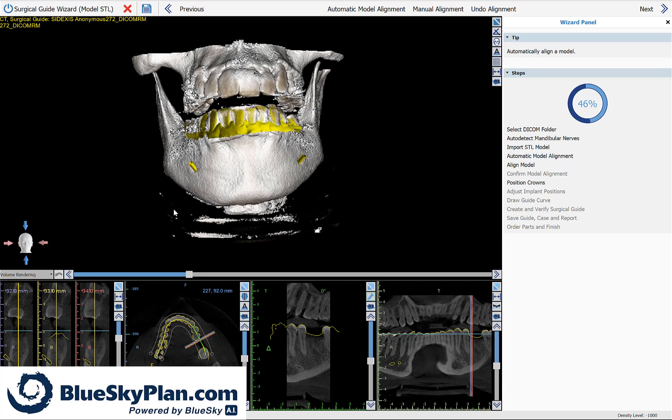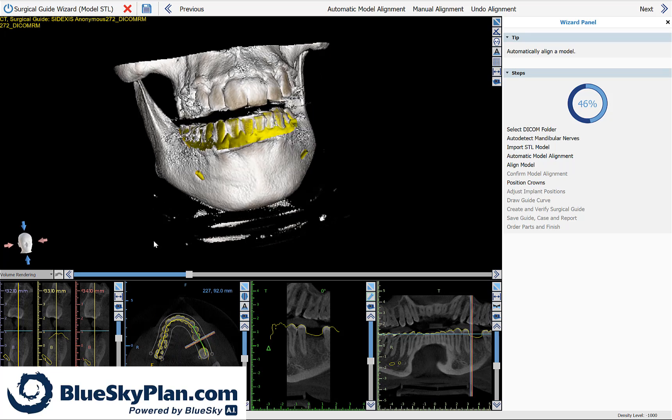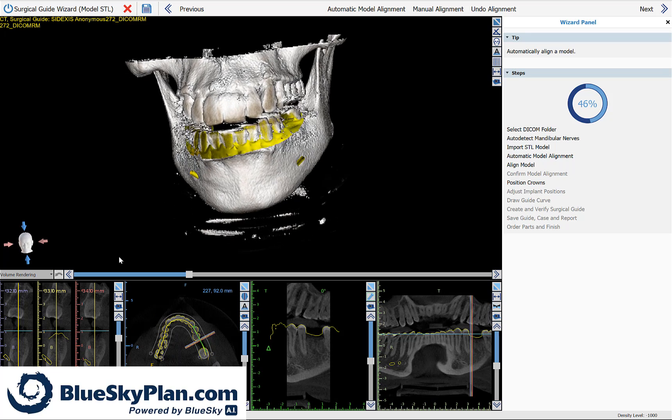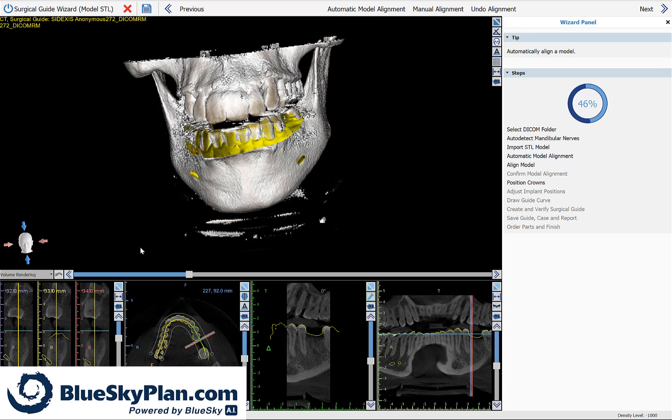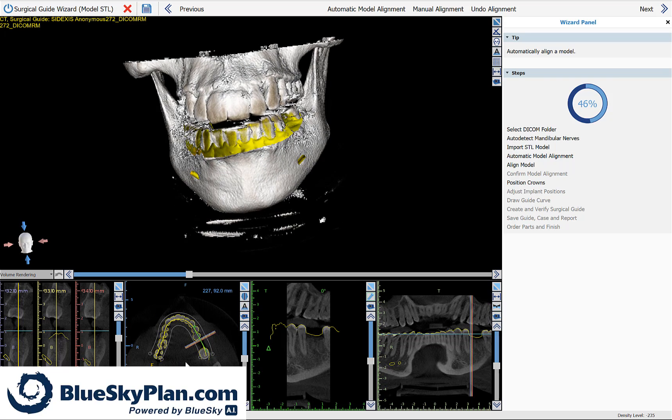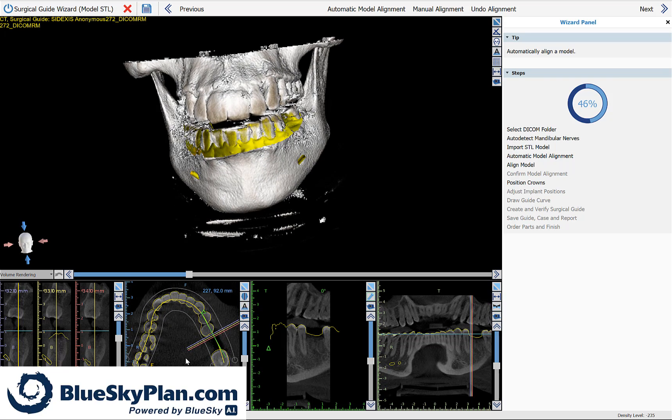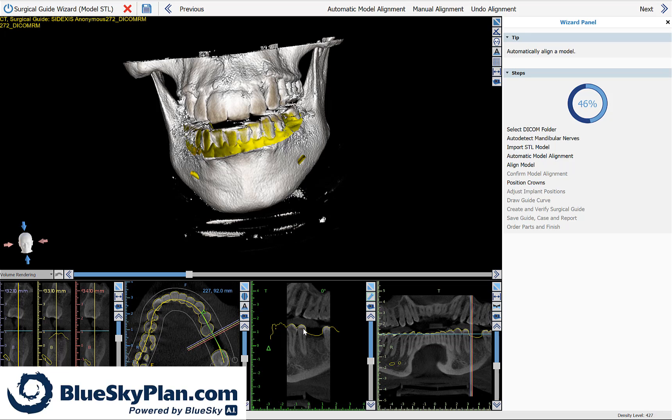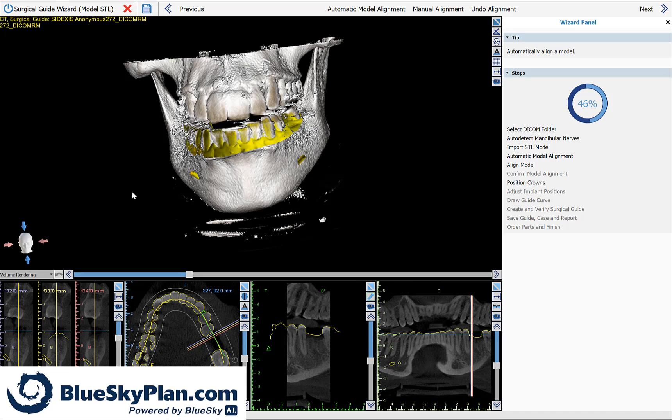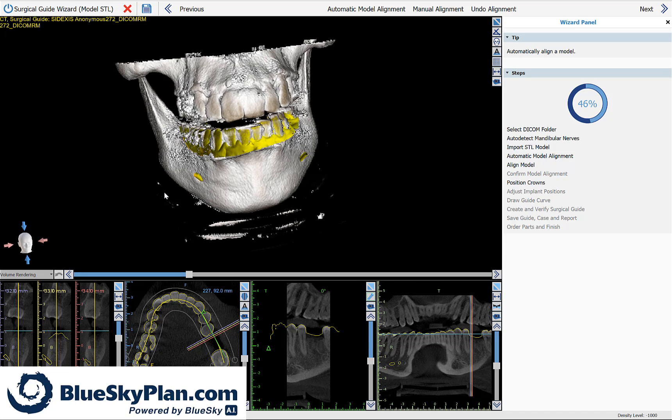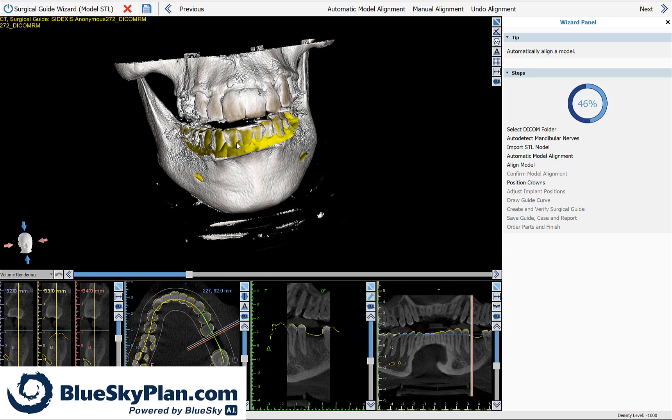You can now see the alignment in your 3D view and in the relevant 2D views. You can see the outline of the model tightly hugging the outline of the teeth. Once you've confirmed the correct model alignment, simply click on Next.